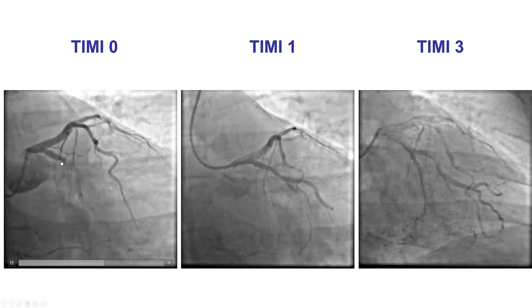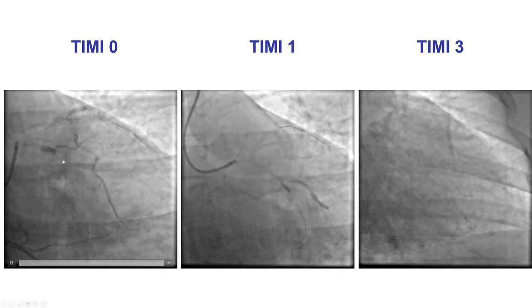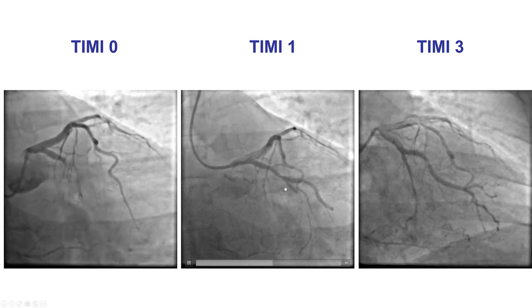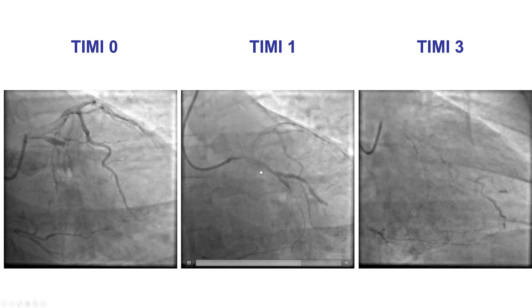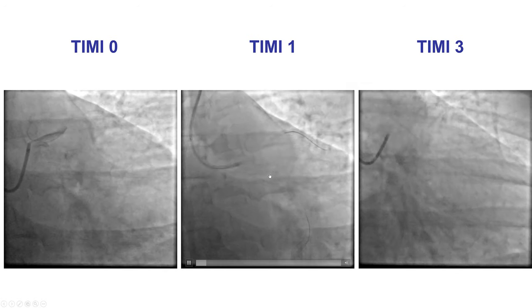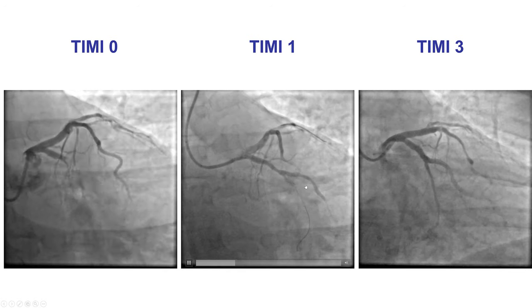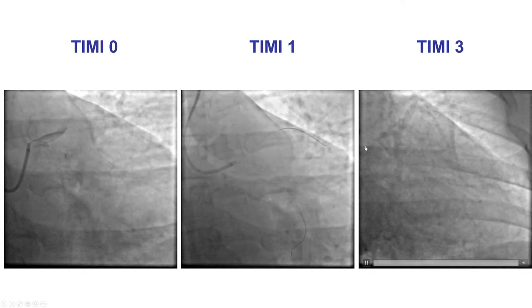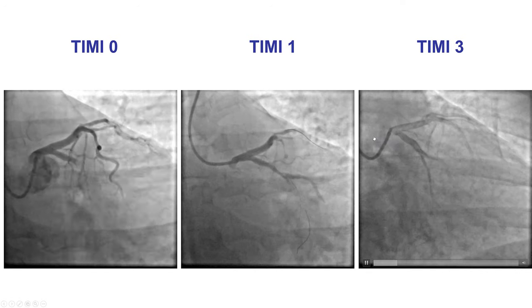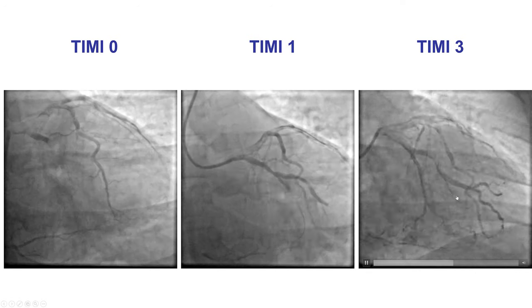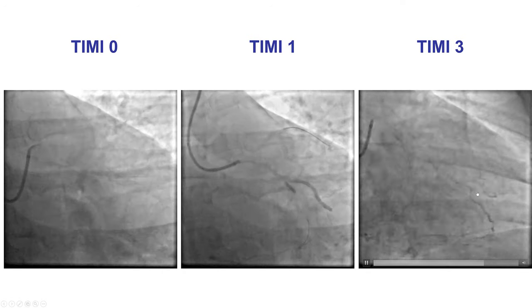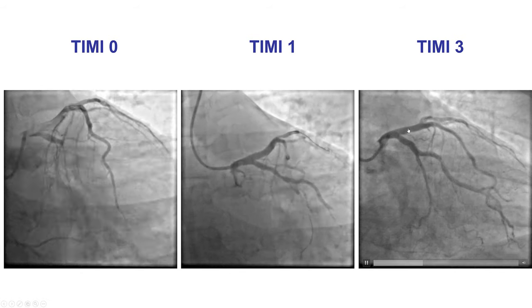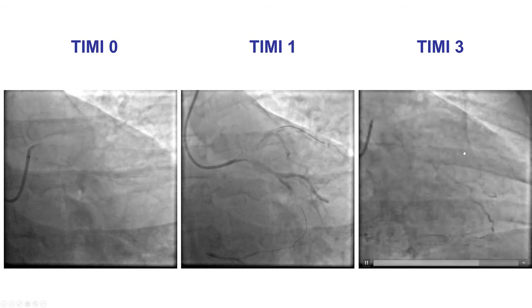This is an example of TIMI 0 — there is no flow past the circumflex. After balloon angioplasty, there is now TIMI 1 flow: some contrast penetration but not reaching the end of the artery. After stenting, there is TIMI 3 flow, with good antegrade flow all the way to the end of the artery at the same speed as flow in the non-involved LAD.